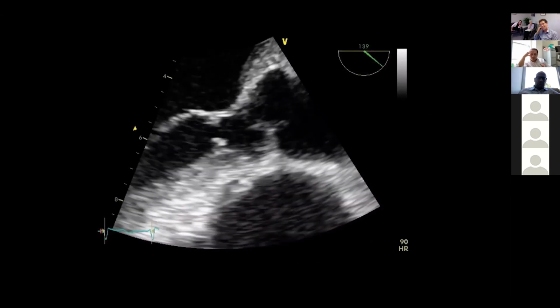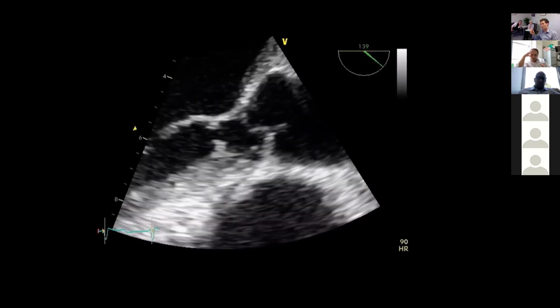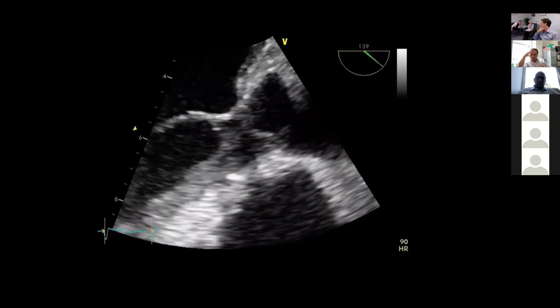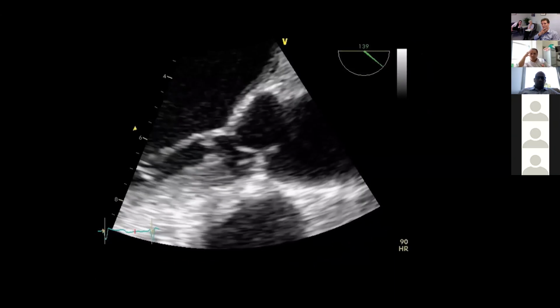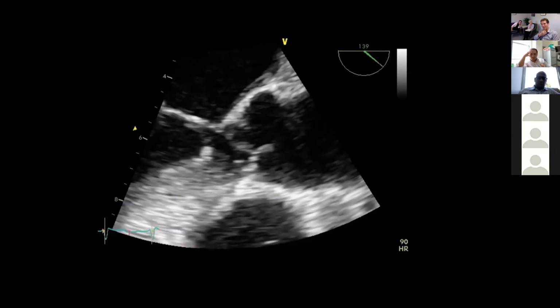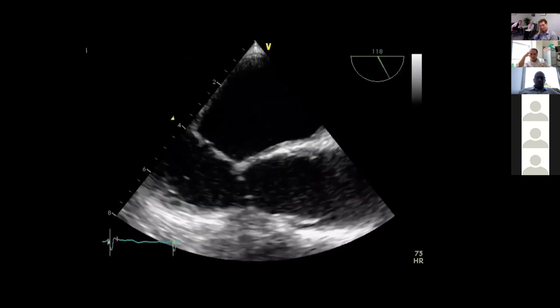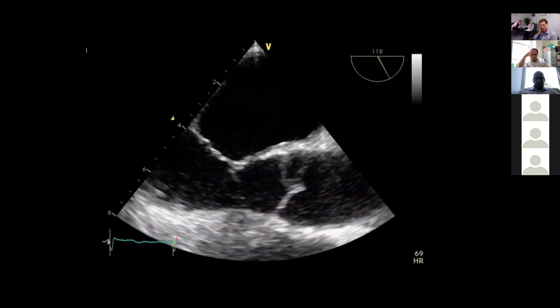And I think as this lady probably became more and more hypertrophied, she's the lady that got that paradoxical severe aortic stenosis, right? It's almost like that, where you get that low stroke volume and the big thickened ventricles. And you can see it in multiple angles here.